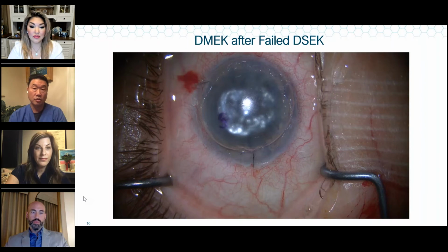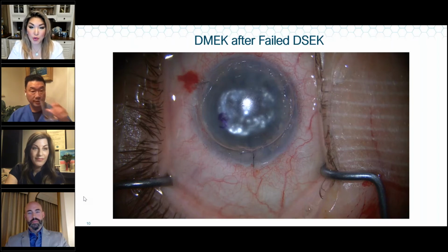Afterwards, I do have them lay flat in the post-op holding area for 30 minutes. We check a pressure, and have the patient sit up to make sure that the meniscus of the bubble is above the PI. I'll be honest, I've become so comfortable with knowing that I'm controlling the gas and that my PI is very peripheral because I did a laser PI before and my bubble had cleared it, I don't even check it at the slit lamp anymore because it's going to be okay.